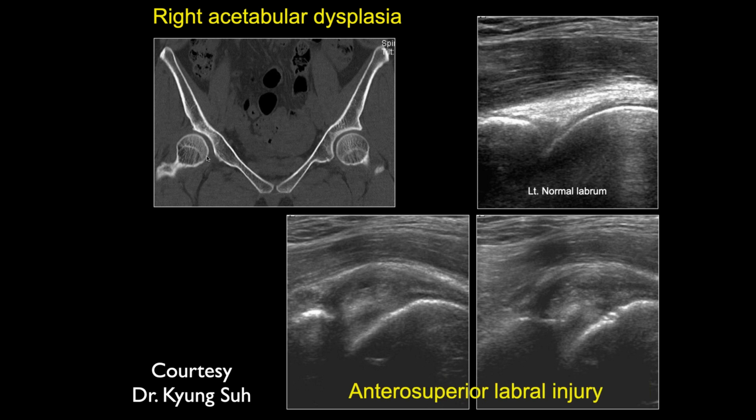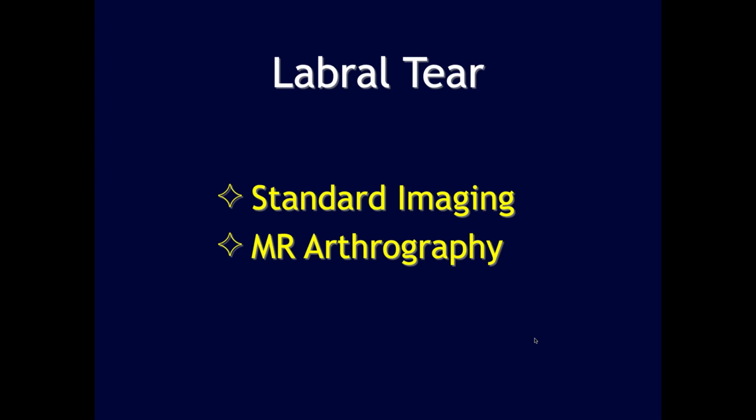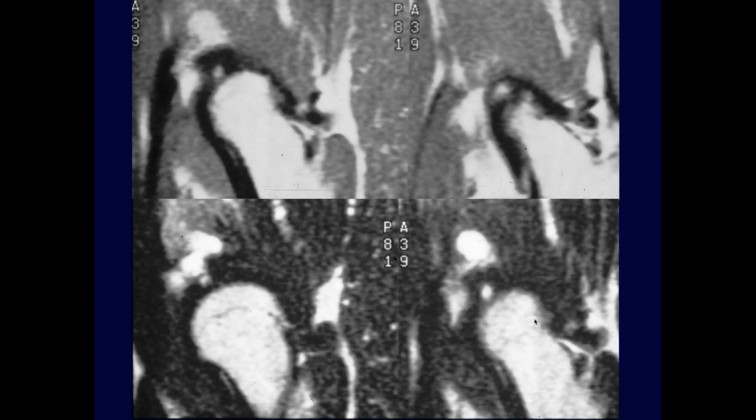And the patient shows a little irregularity here of the labrum, but again, I don't find ultrasound to be, in our hands, a very valuable technique for evaluating labral tears. So let's talk about labral tears. Talk about standard imaging and MR imaging.